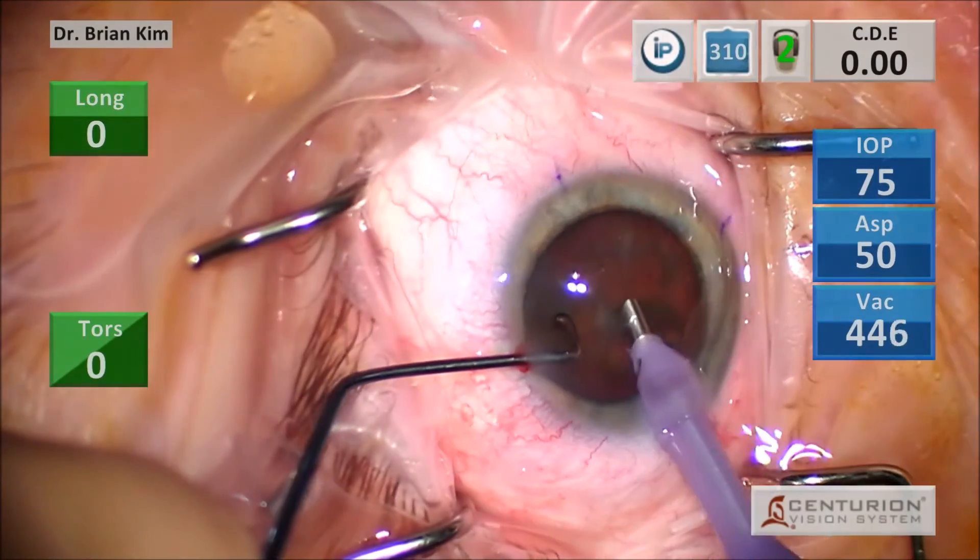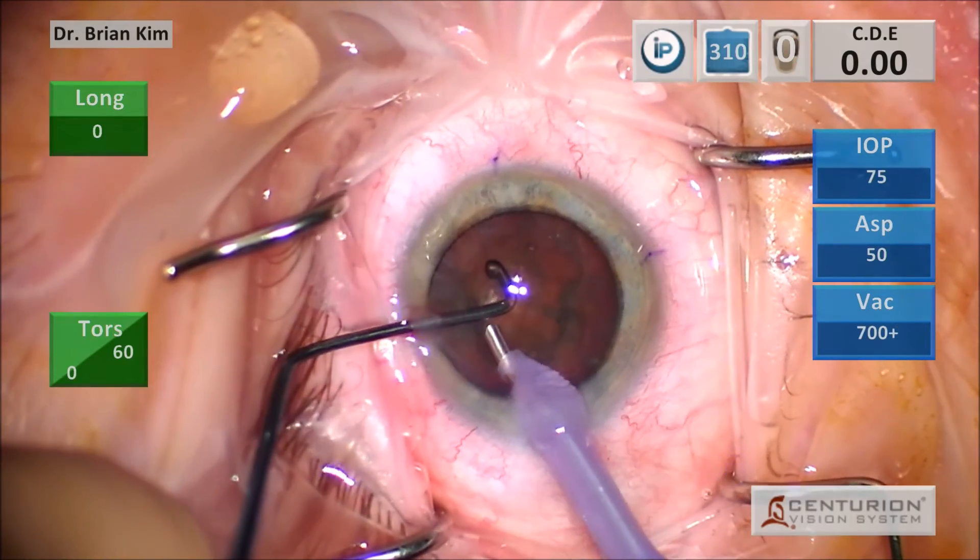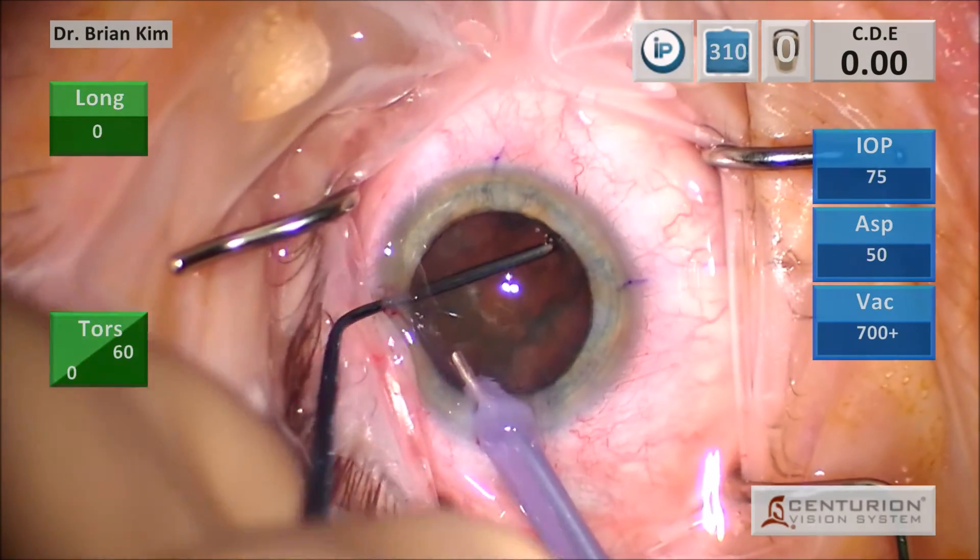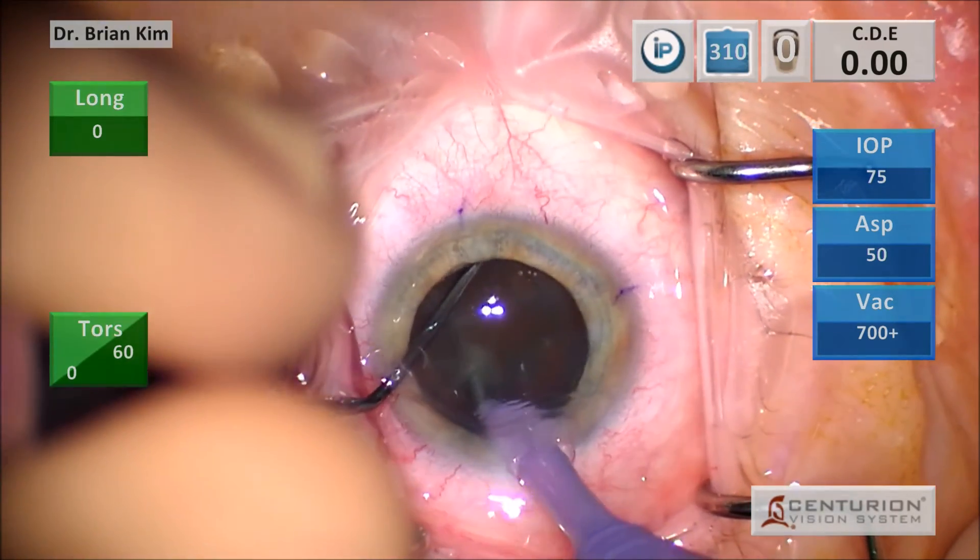I'm able to use that curvature to hold it and support the lens, but also impale the lens with that tip, with the double chop technique for these denser lenses. And you want to take advantage of that pointiness to that tip.